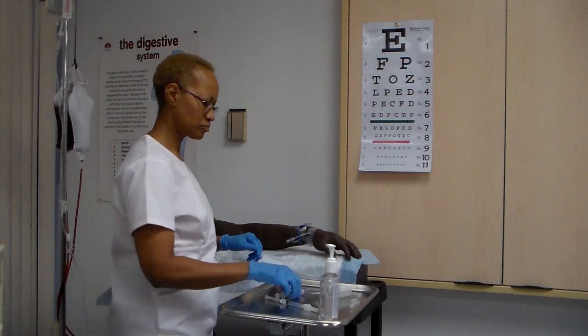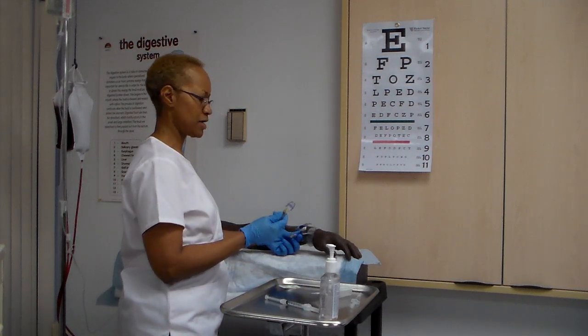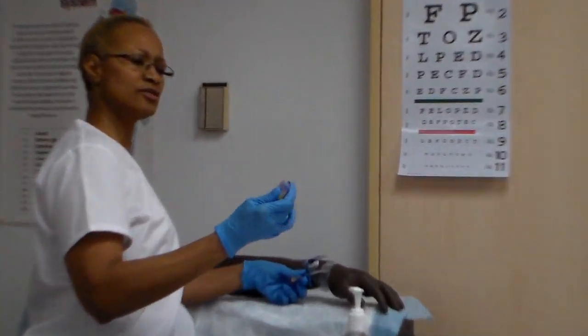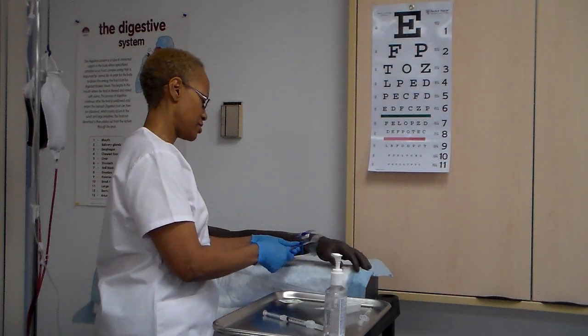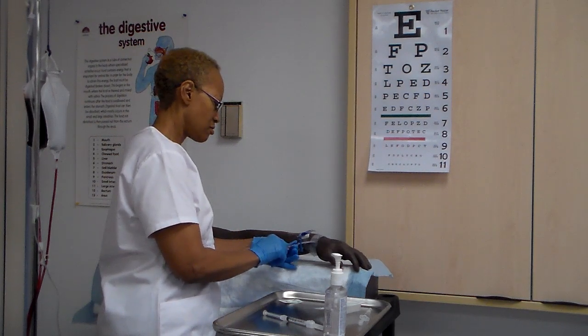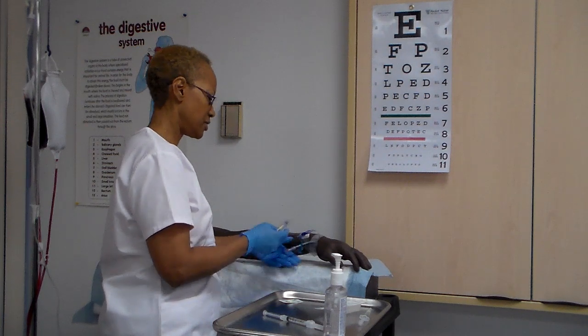Insert syringe containing prepared medication into injection port of IV lock. Okay, so I don't know if you can see this, but this is a needleless system. Wanted to get a chance to show you what the needleless system looks like. Okay, and it has like a little clip on it, so you're going to slide it over your... No, that one doesn't work with this. Wait, let's see.